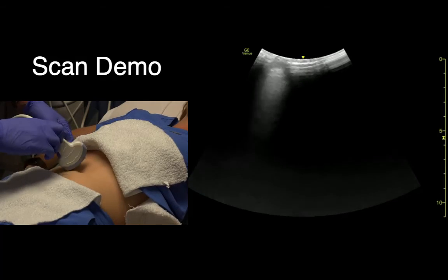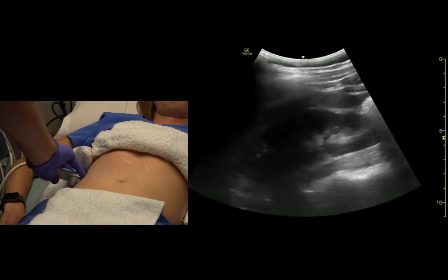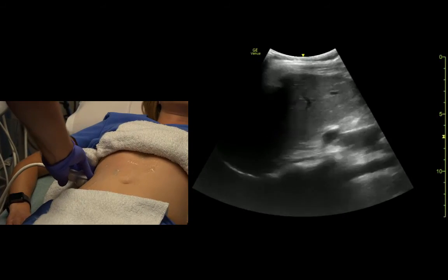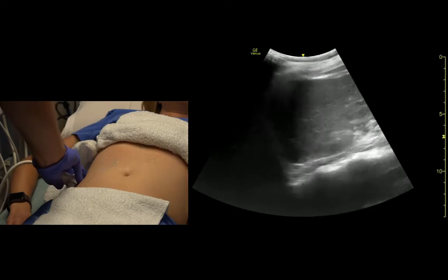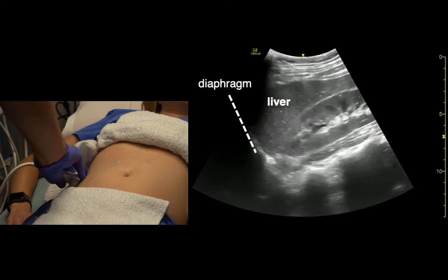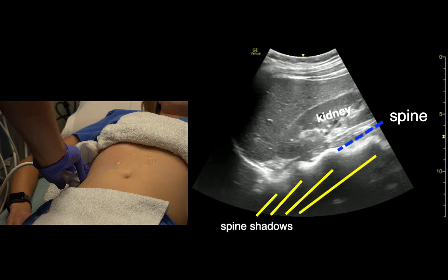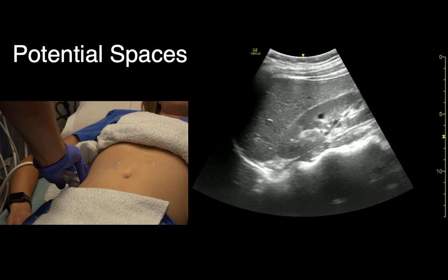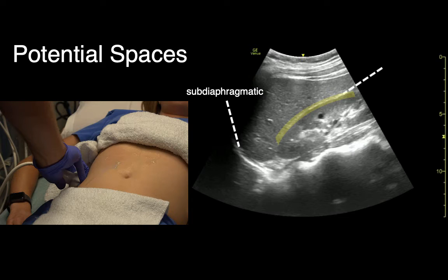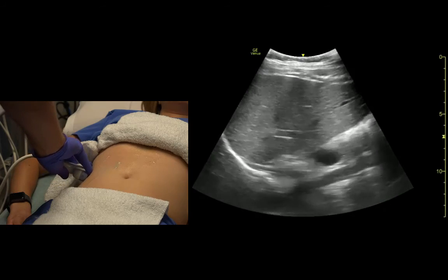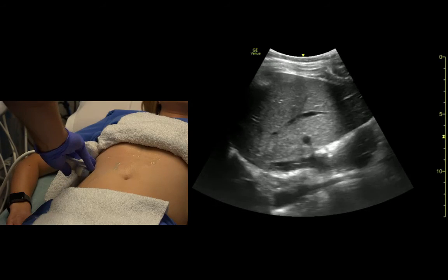Coming from the coronal view of the abdomen with the indicator towards the head, we find the liver from this view. We see the liver below the diaphragm — it's fairly nondescript. If we fan posteriorly, we can see the kidney and the spine. If we get high enough, we can see the aorta and IVC from a coronal section.